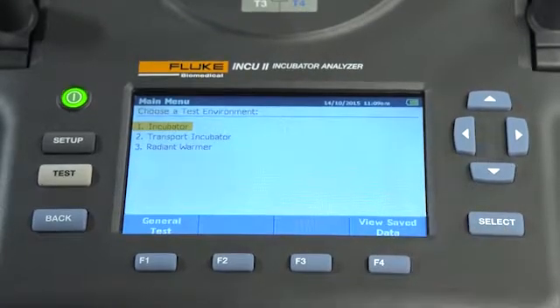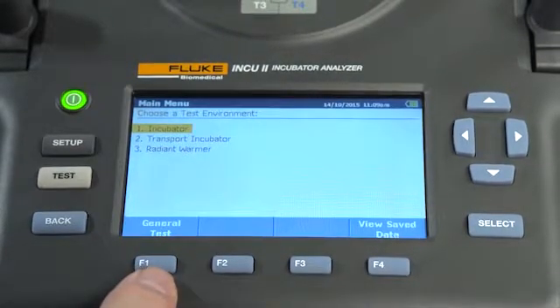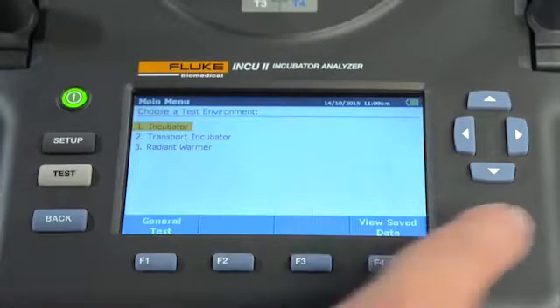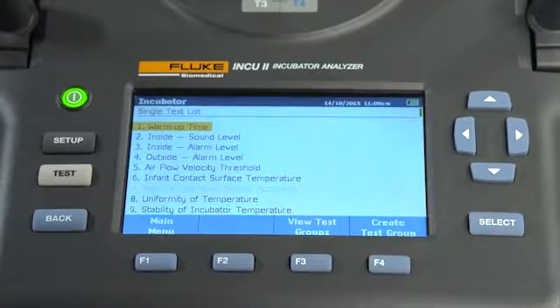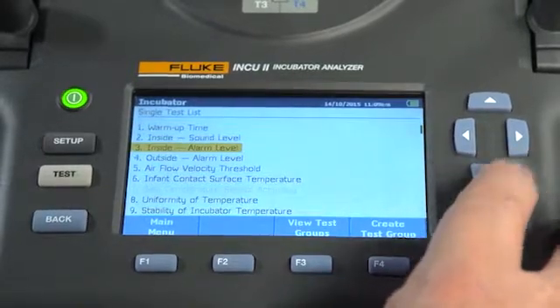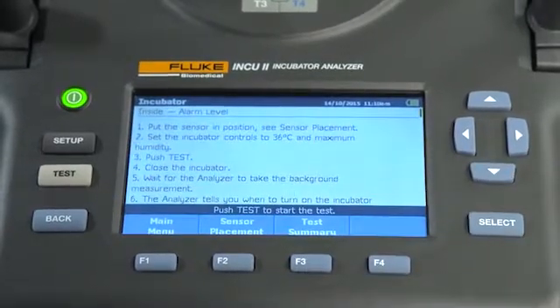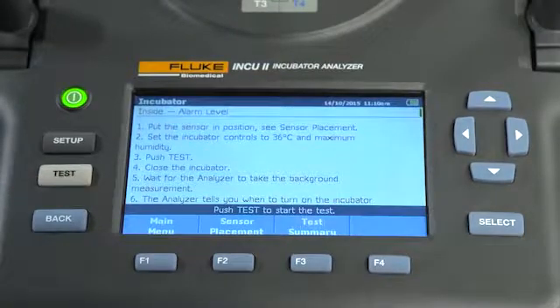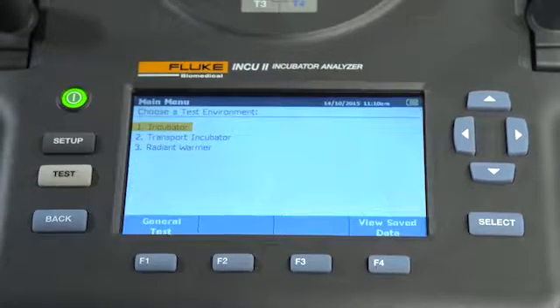You can also choose the general testing option, which allows the user to log data without testing to a specific standard. But in this example, we're going to test to a standard. Let's choose the IEC standard we want to test against. Follow the on-screen directions, then press test. The INQ-2 displays test results in real time, and at the end of a test, either pass or fail indicators will be displayed.